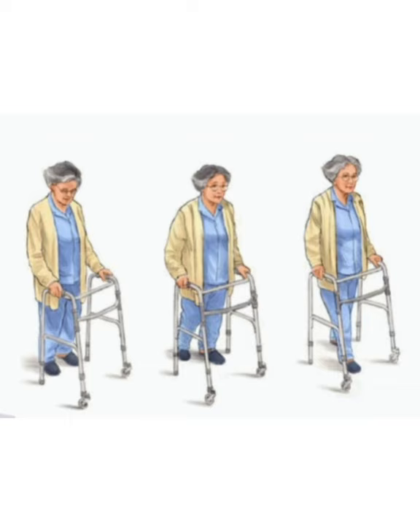If walking with a rolling walker, you continuously progress the walker forward while you walk right, left, right, left, and so on. Be sure to maintain good posture to avoid stooping forward, but keep from getting too close inside the walker, because this can also throw off your balance.